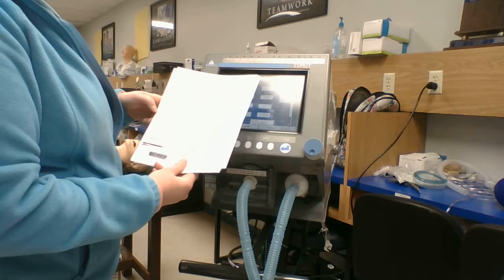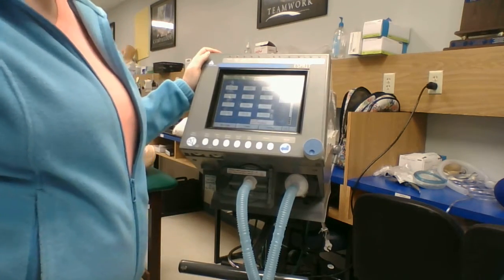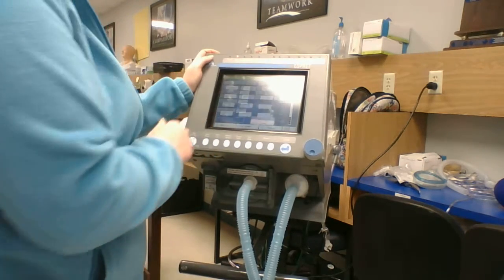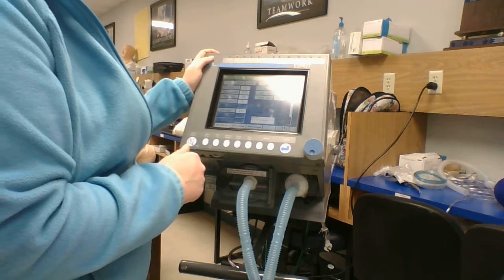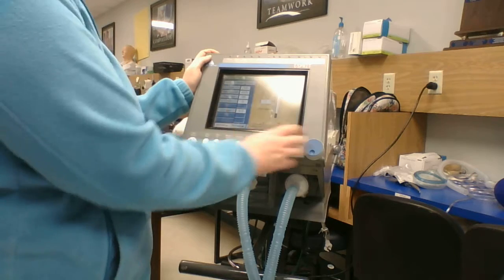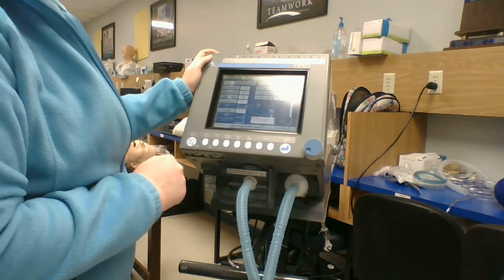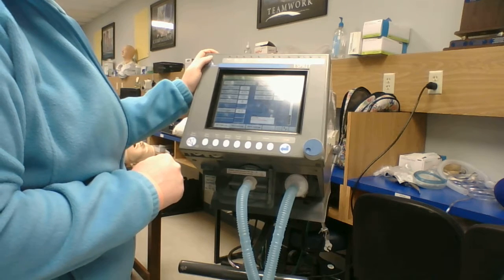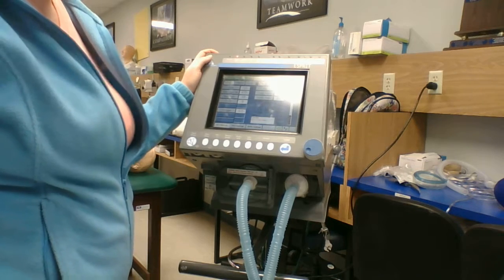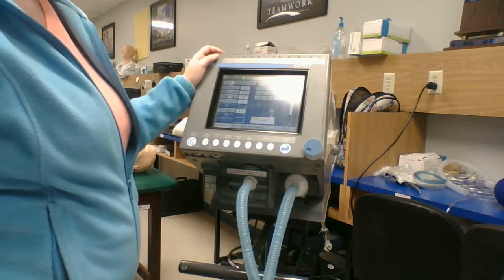I'm also going to check the patient, make sure I assess them, and adjust anything as needed. Maybe I need to increase the PEEP, so I can put that up to 8. So pretty much just start at my standard settings and take my patient's ideal body weight and work from there and adjust it.